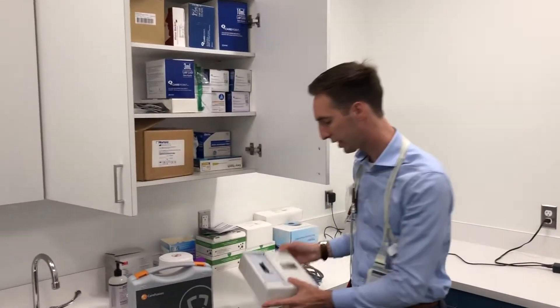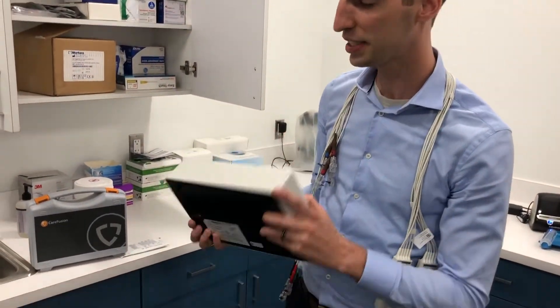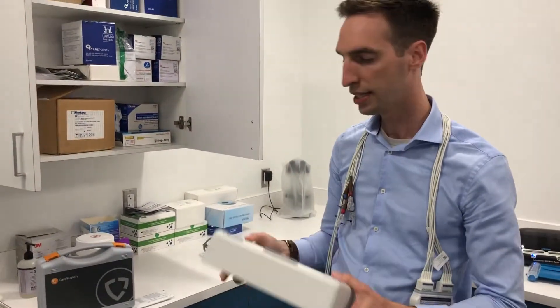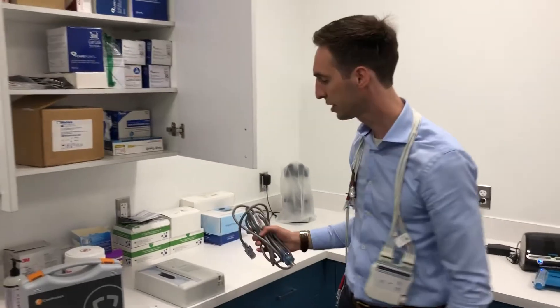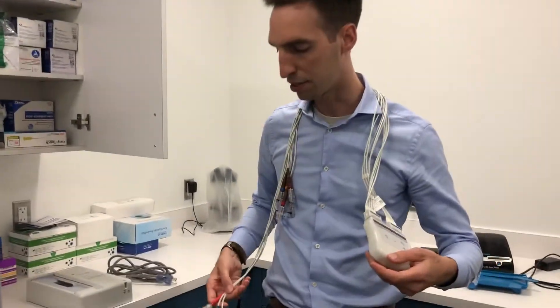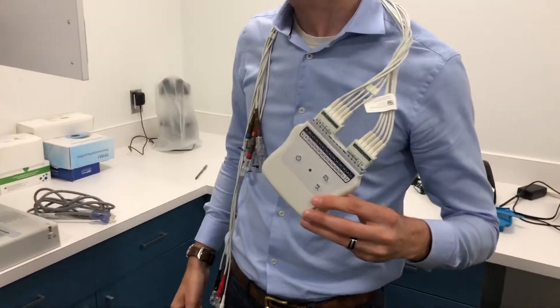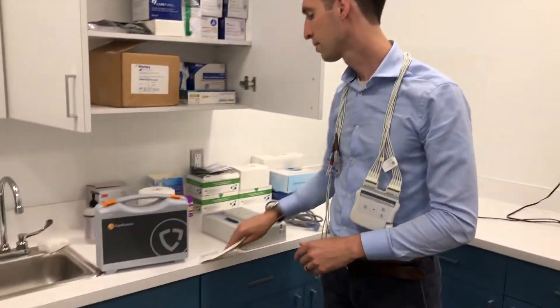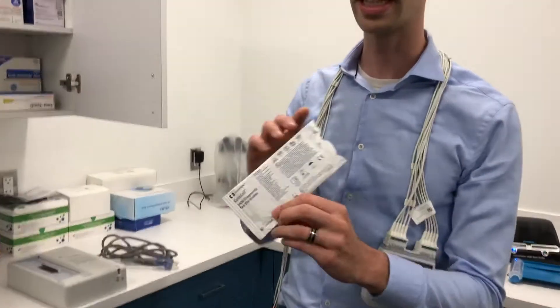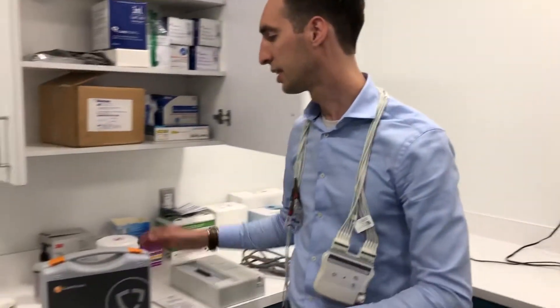We use the Burdick Eli 230 EKG machine. I love it because it's really light and we can just carry it into the room, set it on the tray table, plug it into the wall, and then we have a wireless monitor. So our 12-lead EKG is wireless, which is a great feature. We just set this on the patient's chest, put all the leads on, and the leads are really inexpensive — you can get them for a few dollars on Amazon and I can link that in the comments.